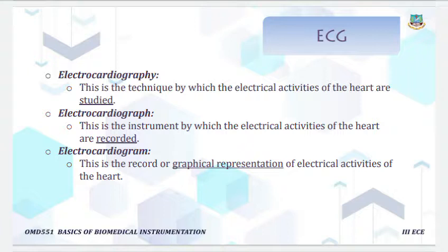What are the differences? Electrocardiography is the technique by which the electrical activity of the heart is studied.